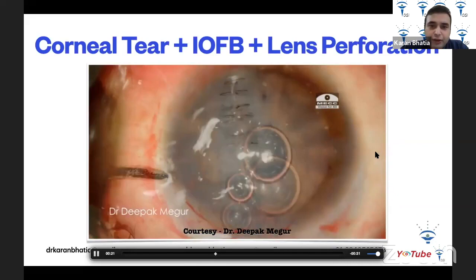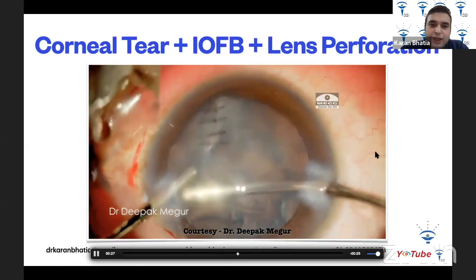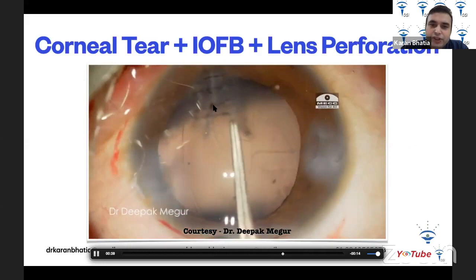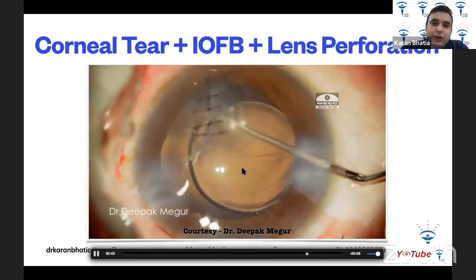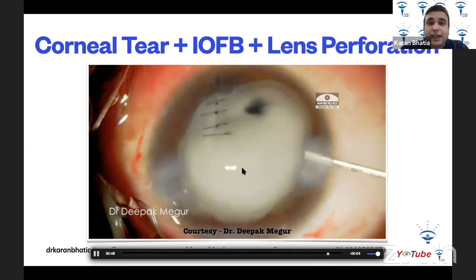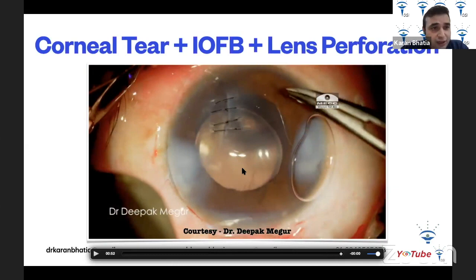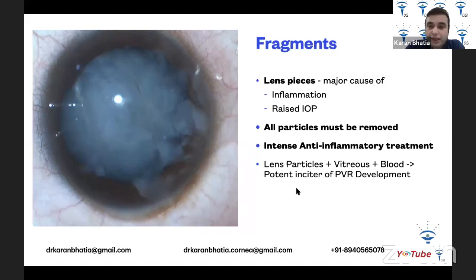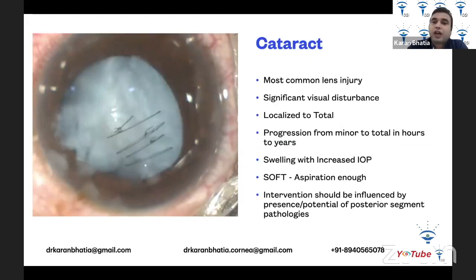The corneal tear is sutured with meticulous suturing, followed by irrigation-aspiration to remove all the lens matter. The anterior capsular tear is converted into a somewhat CCC, and a three-piece IOL is placed into the sulcus with optic capture — the haptics in the sulcus and the optic in the bag. It's important to always inject triamcinolone and check for vitreous. Lens fragments in the anterior chamber are a major cause of inflammation and raised IOP. Lens particles plus vitreous plus blood in the anterior chamber are a potential instigator of PVR development.